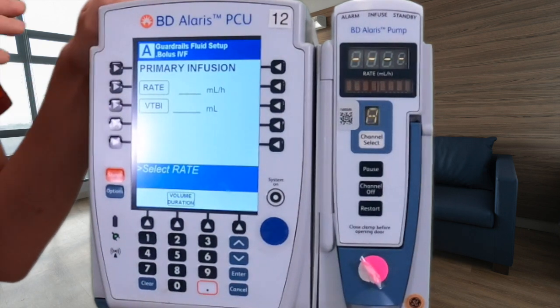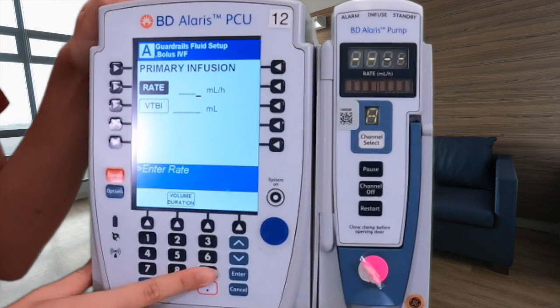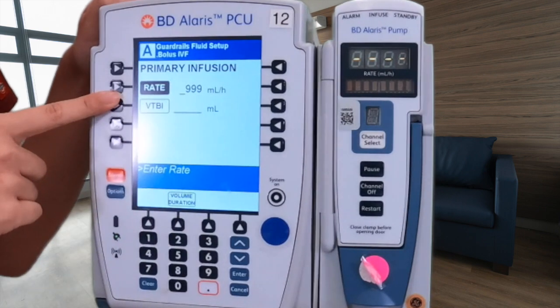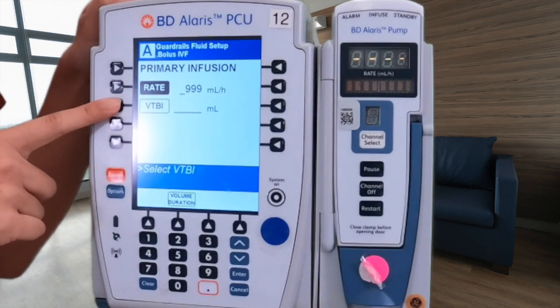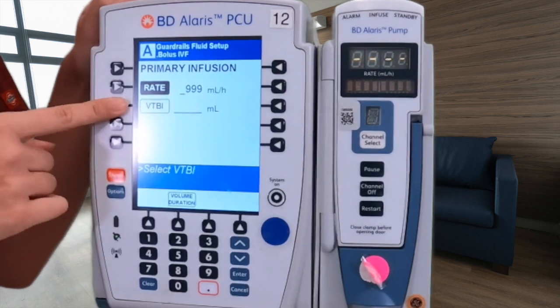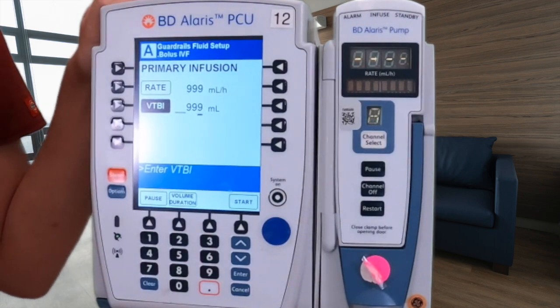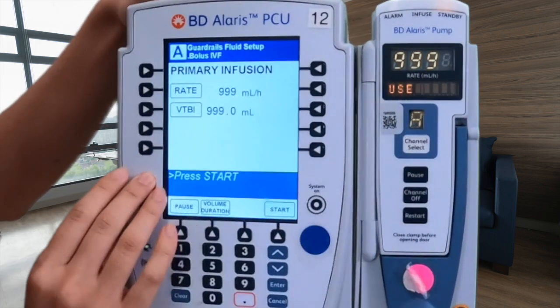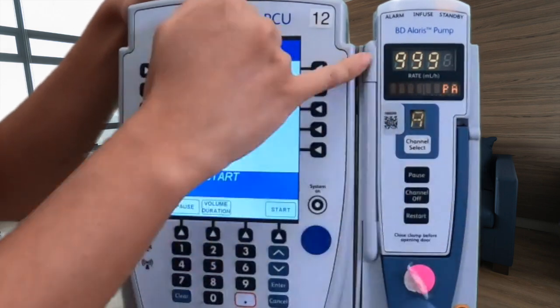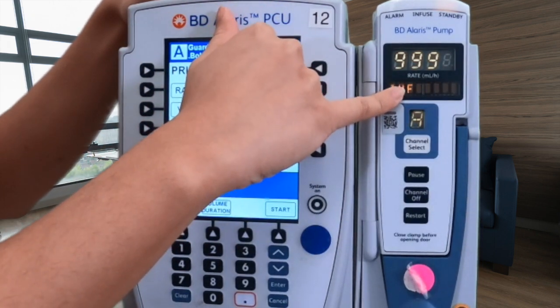Now we are going to do another check of our orders. Our rate is going to be 999 milliliters an hour, and our volume to be infused is one liter. This pump does not go to 1000 milliliters, so we're going to go to 999 milliliters. Over here on our right we have the information for this line — 999 milliliters an hour, and it says bolus IVF.